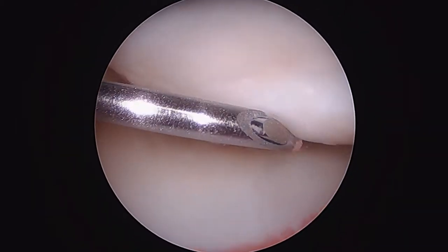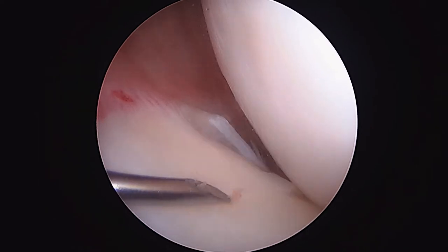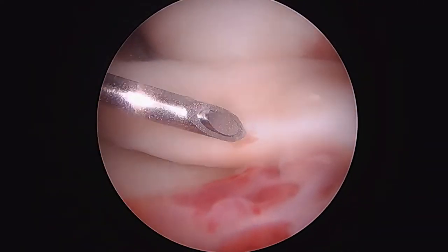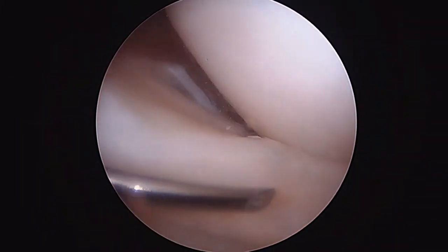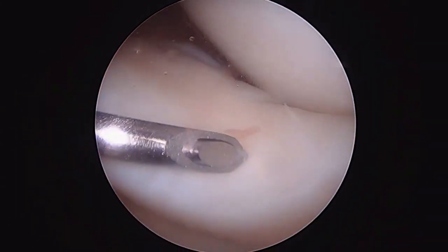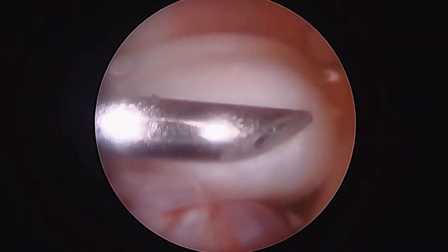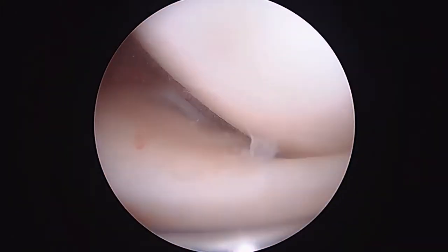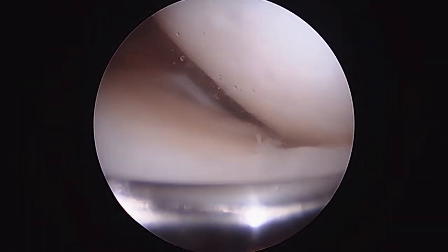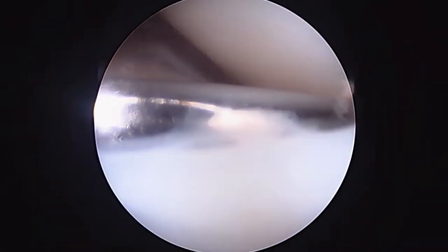We've harvested two nice hamstring tendons. Here's the initial view into the medial compartment — here's the medial meniscus. You can see this tear; it's really what we call a bucket handle tear. It wasn't when we started, but because of the injury, it can slip into the joint like it has here. We're going to reduce that and do our best to repair it. You can see how it sits over in the central part of the knee and the notch — that meniscus needs to be addressed. We can't just leave it like that.